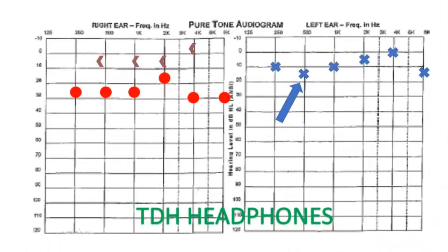Here we have a mild hearing loss in the right ear with some unmasked bone conduction responses. We don't know which ear these bone conduction results are coming from, and we want to know what kind of hearing loss is happening in the right ear. So we'll need to mask. The left ear is our non-test ear. That ear will need to be masked. It's slightly asymmetrical, but not enough to use the optimized method. We'll use the plateau method.